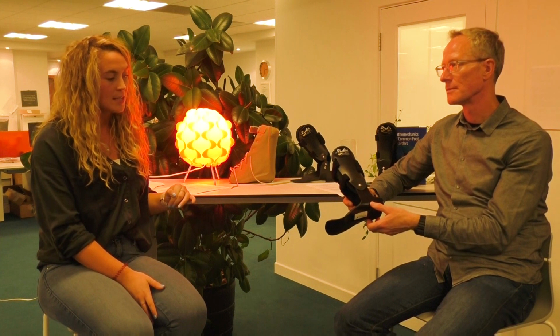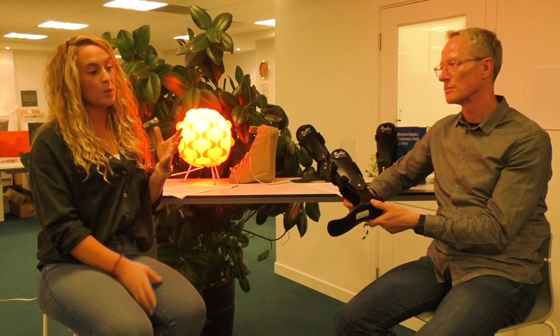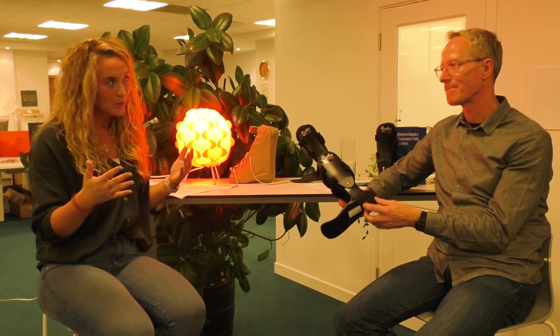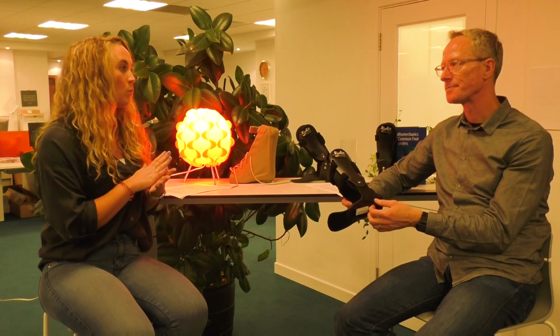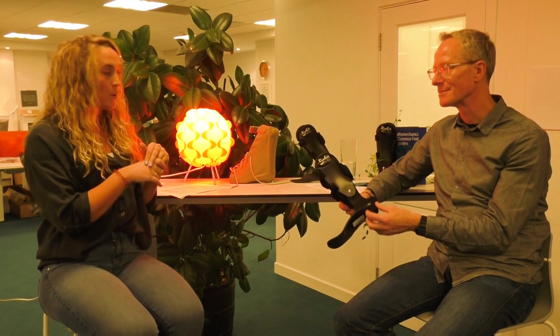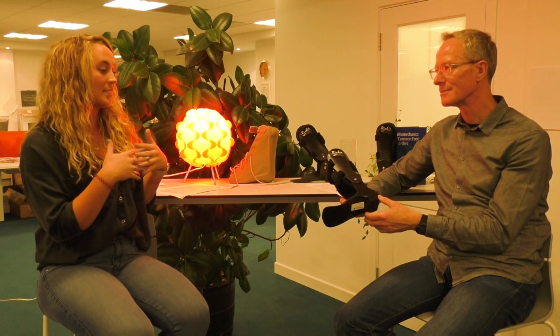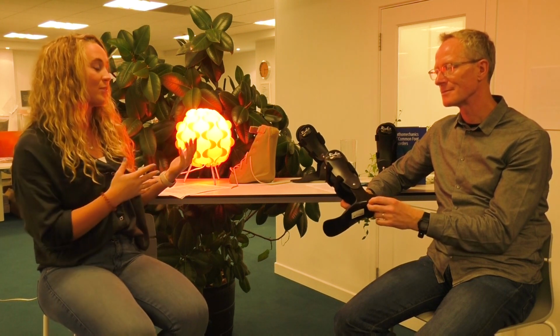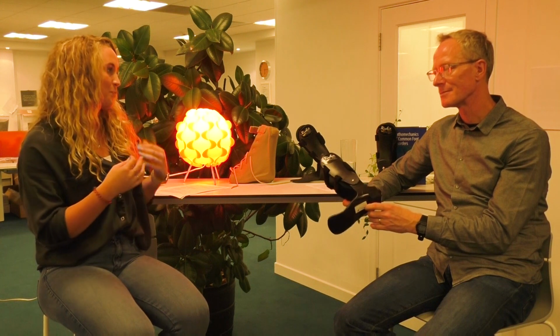It was also difficult because the term of success, a successful outcome, is different across all the evidence. So some people would see a successful outcome as they don't wear anything. They don't wear a custom-made foot orthotic or a brace. But from my point of view, I think a successful outcome is that they can return to activity pain-free. So that's also difficult when we all have kind of different goals.